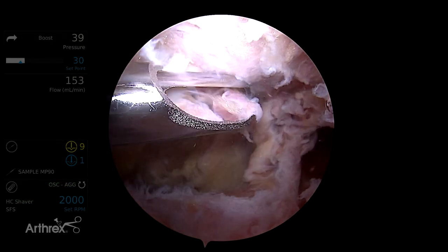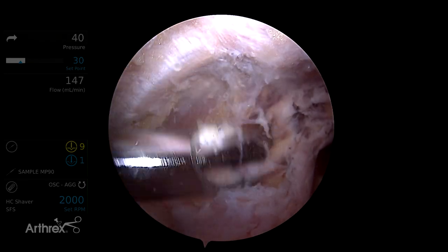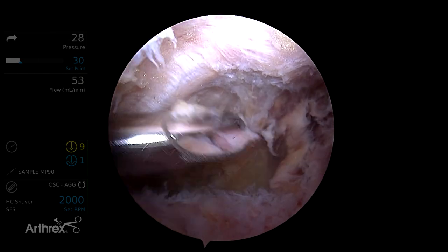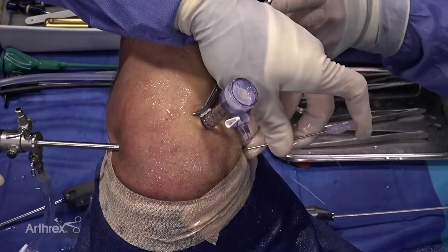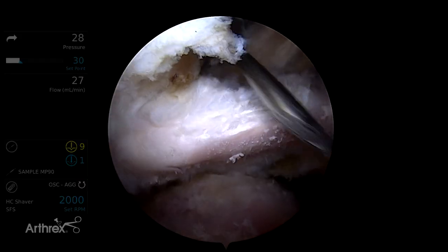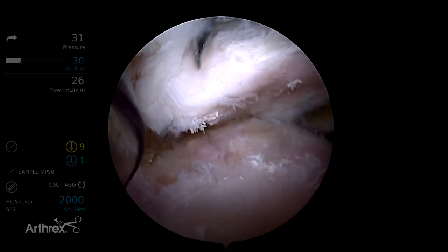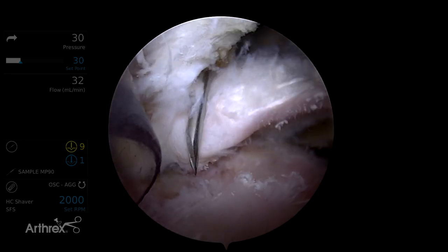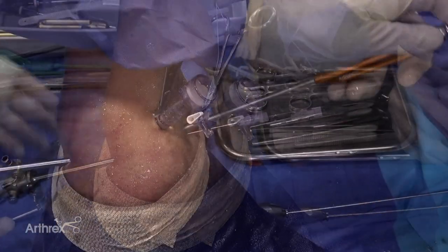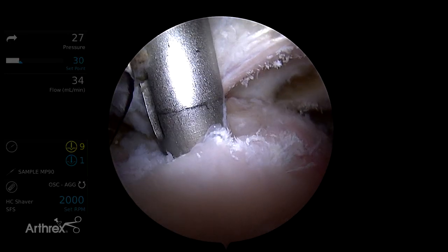With the 70-degree arthroscope, here's our coracoid anteriorly. We can now assess the coracohumeral interval — we look for a space of seven millimeters or more, and in this case it's preserved, so we don't need to do a coracoplasty. If it were less than seven millimeters, I would do a coracoplasty taking care to preserve the conjoined tendon anteriorly. Now I'm going to place my medial anchor, using a spinal needle as a guide to determine the adequate angle of approach, staying lateral to the coracoid and just medial to the comma tissue. Here we have a good angle, and we can insert our guide percutaneously.